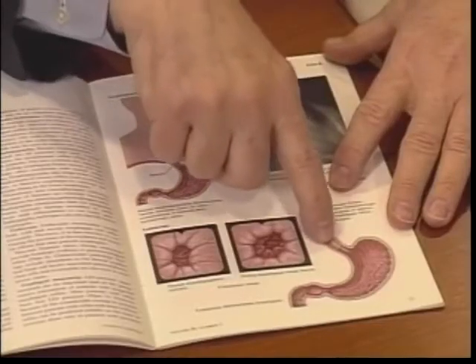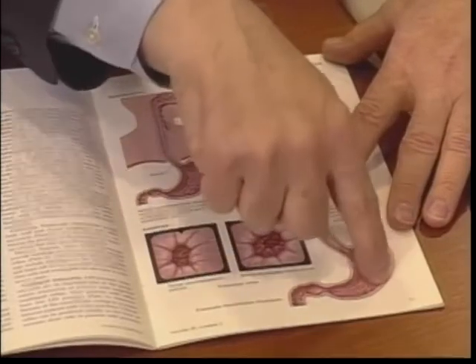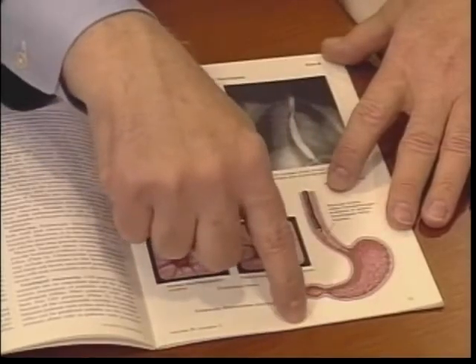Janet, based on the symptoms that you described to me, I think that an upper GI endoscopy should be performed. Could you tell me what that's all about, Dr. Dean? An upper GI endoscopy is an examination of the upper gastrointestinal tract, from your throat down to just past your stomach. This procedure lets your doctor or gastroenterologist see a detailed view of your entire upper digestive tract to correctly diagnose or treat any problems you may be having.